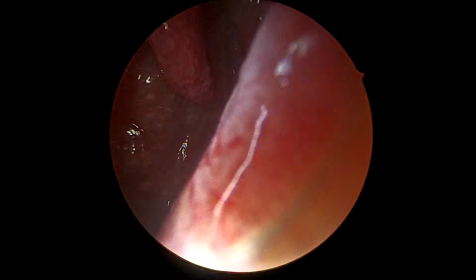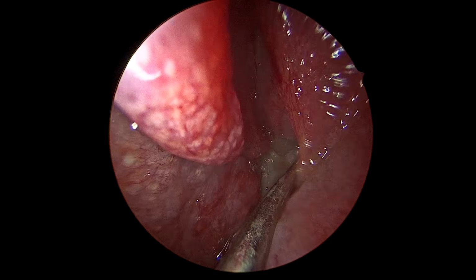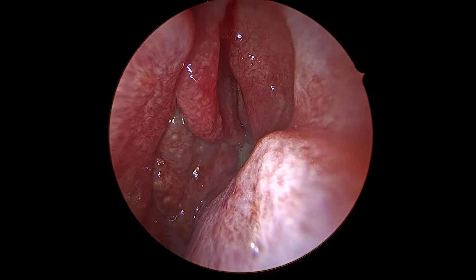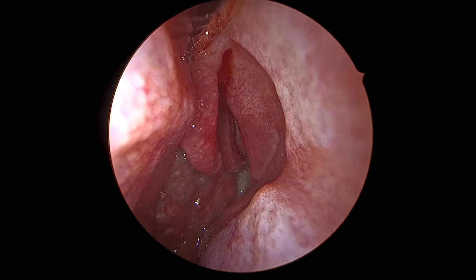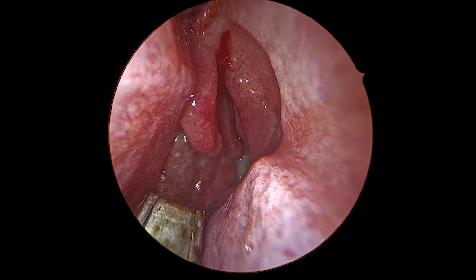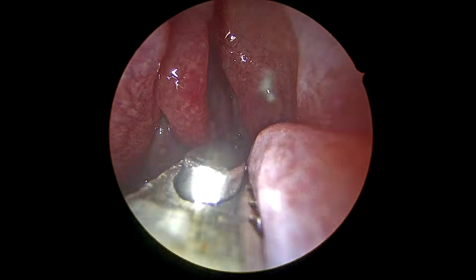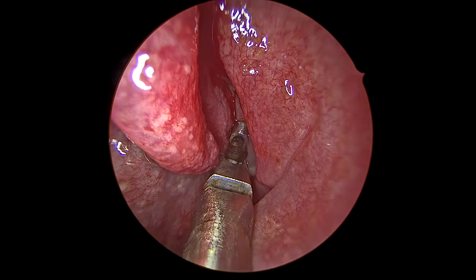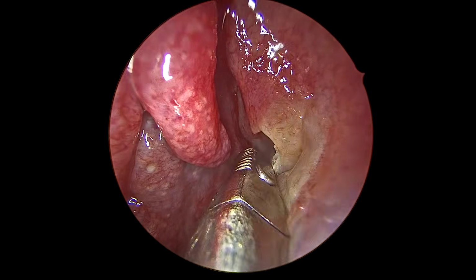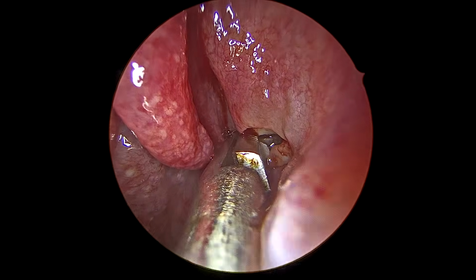So I decided to do a CT scan for this patient. The CT scan showed a soft tissue mass exactly in the location which I described, and there was no bony erosion or any contrast uptake. But you can see this was not a picture of a typical nasal polyp, because nasal polyps are mostly pale and polypoidal. The look seems more like a soft tissue tumor. So, giving the benefit of the doubt, I took the patient for general anesthesia and for excision of this mass.